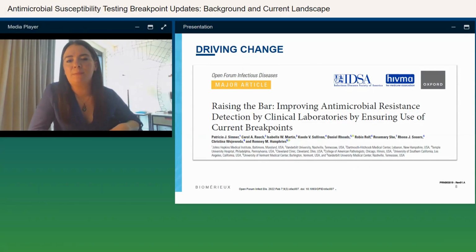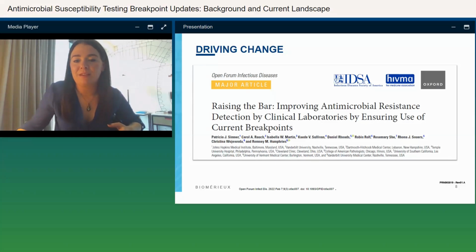And so to dive a bit deeper into this, they sent out an additional survey along with a routine proficiency survey to ask laboratories what they were using. And the findings from this study really helped paint a landscape of the current need to update these breakpoints, and it was actually pretty surprising.